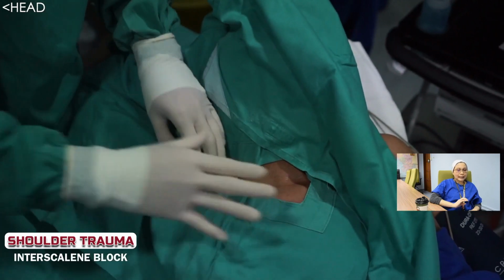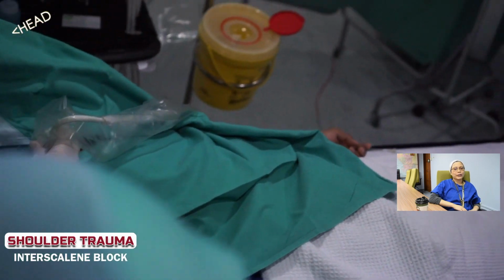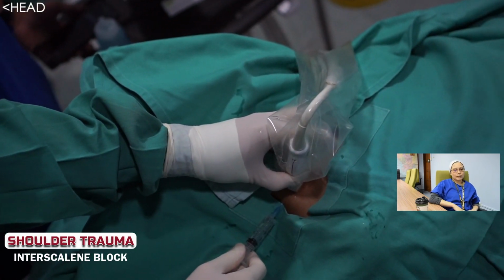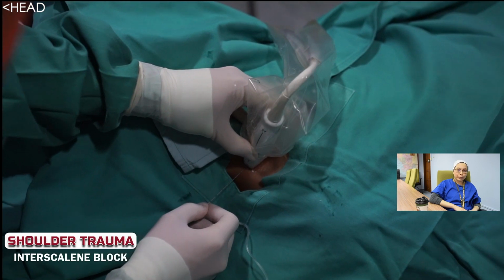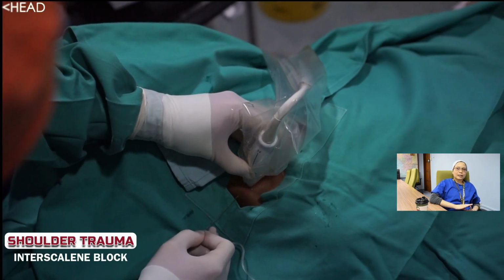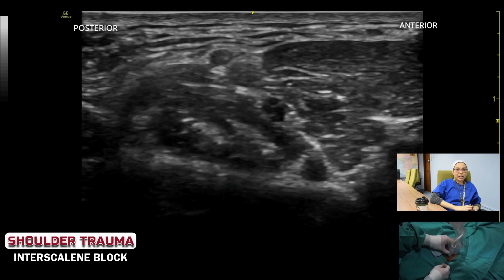The brachial plexus is identified, and then the probe is moved cranially until the grape-like brachial plexus changes to a traffic light-like appearance. Most of the time, the final probe position is at the middle of the neck, slightly posterior to the sternocleidomastoid muscle. Then, using an in-plane approach from the posterior end of the probe, the needle is inserted aiming towards the C5 and C6 roots. It is not advisable to insert the needle in an antero-posterior manner, as the phrenic nerve lies in between the sternocleidomastoid and the anterior scalenus muscle.